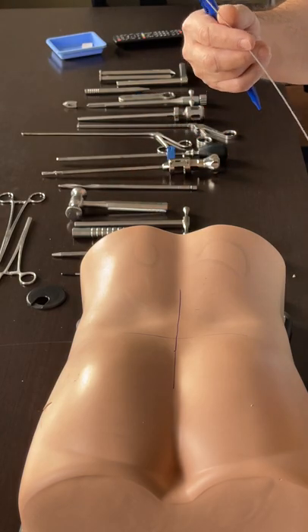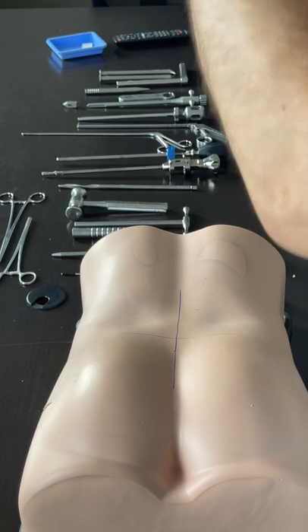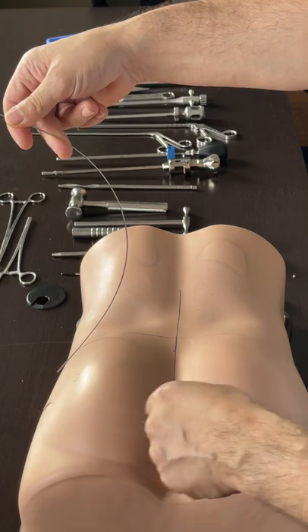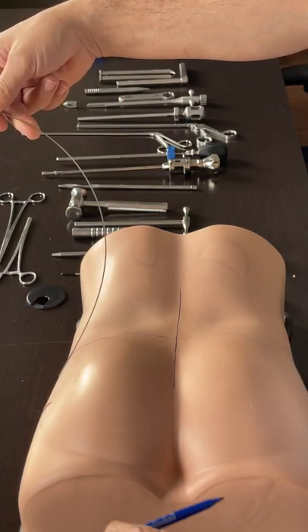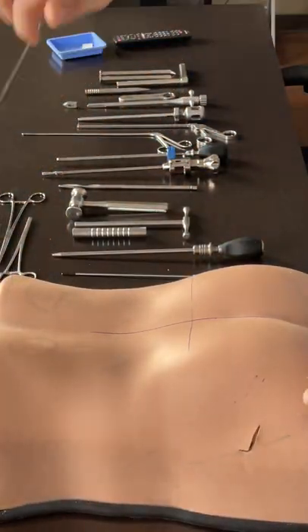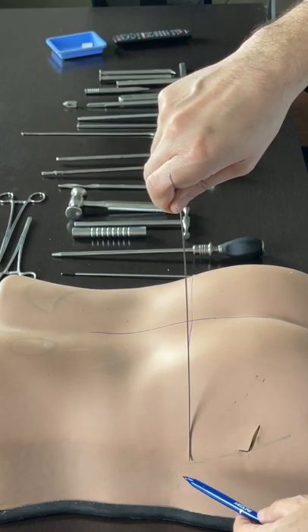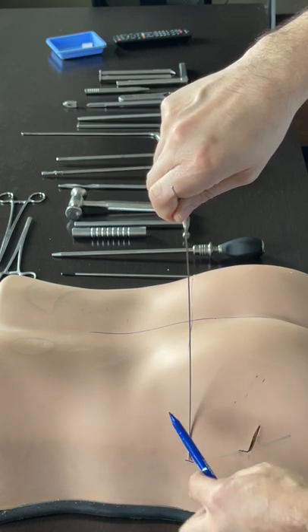On the lateral - the camera is up, the x-ray source is down - I use the elasticity of the wire itself and mark the middle of the disc, of the level. The end plates are well visible. I'm in the lateral view, I'm in the middle of the disc, I mark it.